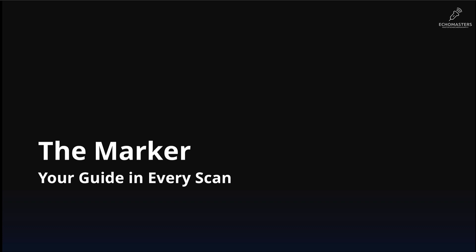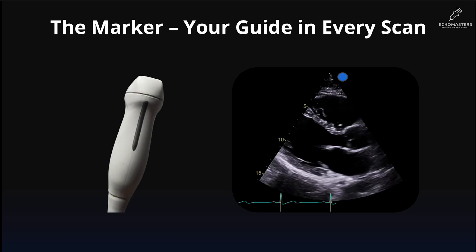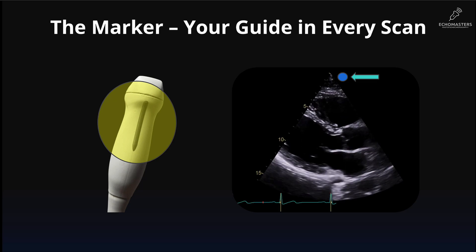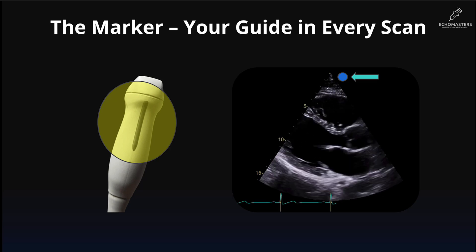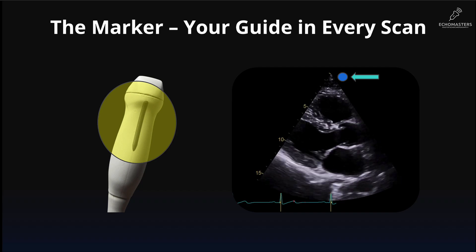Now look closely at your probe. You will see a small dot, marker, or ridge — this is the orientation marker. This marker corresponds directly to the marker on your ultrasound screen. This is the single most important concept in all of ultrasound. If you get this wrong, everything will be backwards. The dot on the probe equals the dot on the screen.